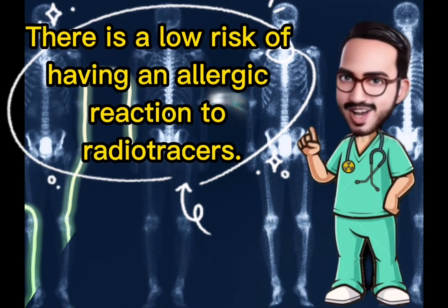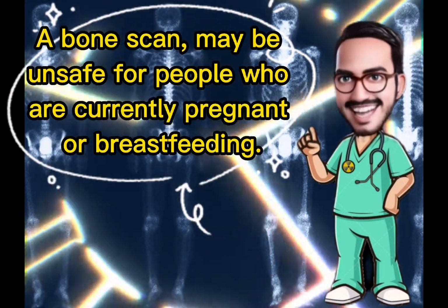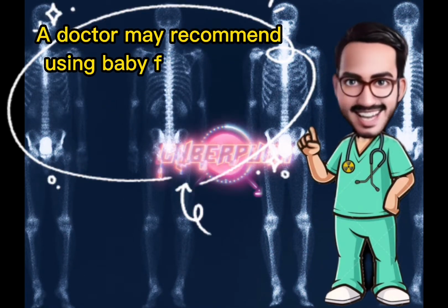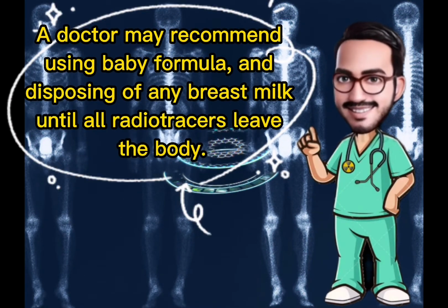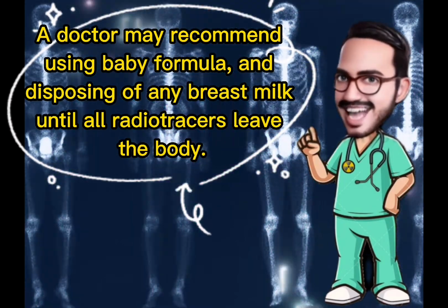There is a low risk of having an allergic reaction to radiotracers. A bone scan may be unsafe for people who are currently pregnant or breastfeeding. A doctor may recommend using baby formula and disposing of any breast milk until all radiotracers leave the body.